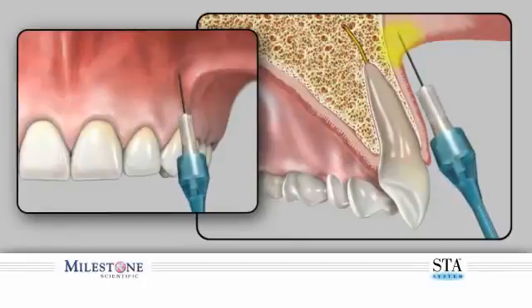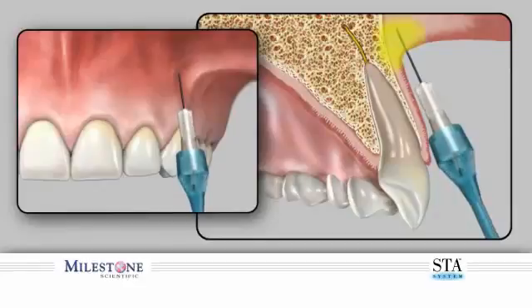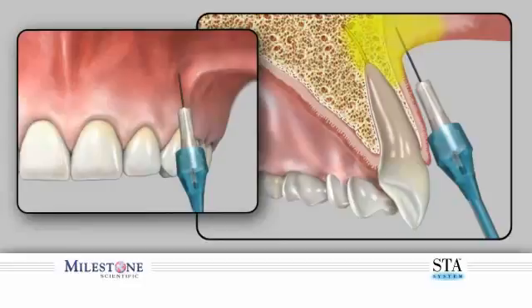If an aspiration test is required for the specific infiltration, perform an aspiration by depressing and releasing the foot control pedal. If the aspiration is negative, you can continue the infiltration injection and administration of anesthetic solution to the area. If aspiration is positive, reposition the needle and perform another aspiration by depressing and releasing the foot control pedal. Once you've achieved a negative aspiration, it is recommended that you administer at least 1/4 of the cartridge at the control flow rate before transitioning to the rapid flow rate.